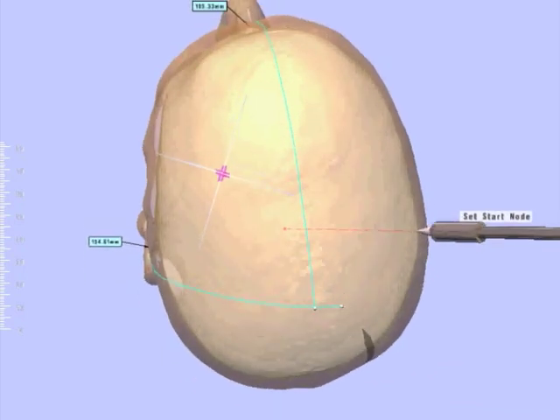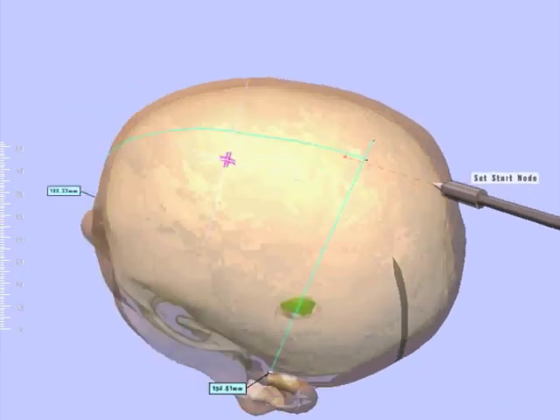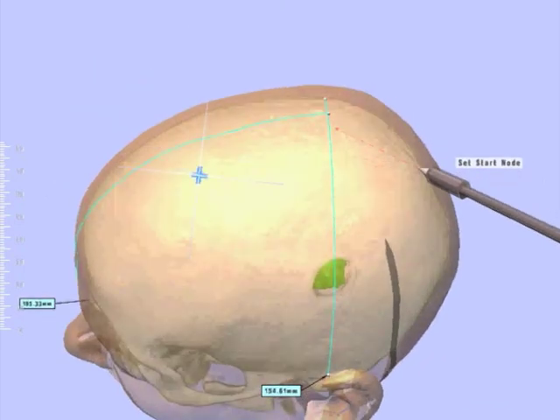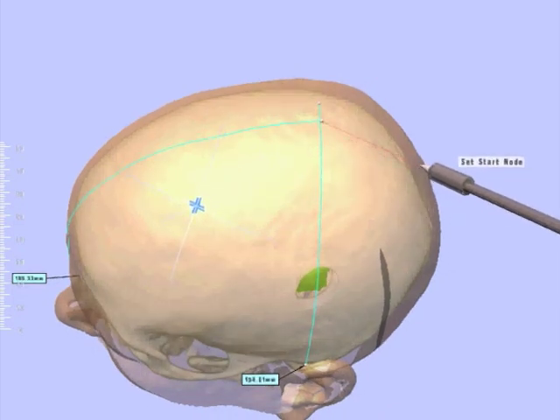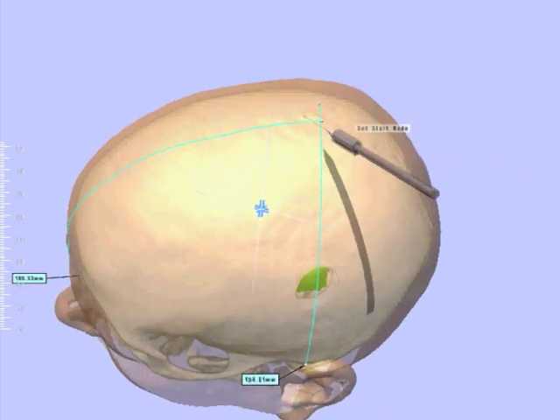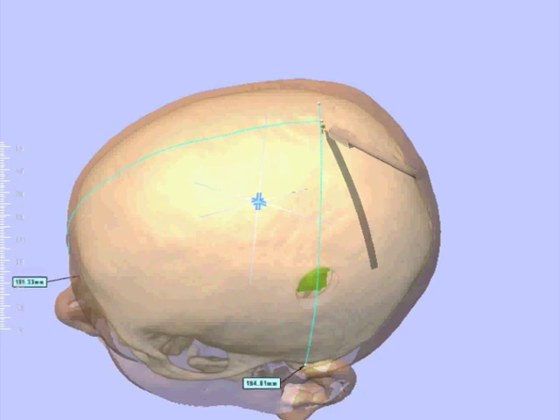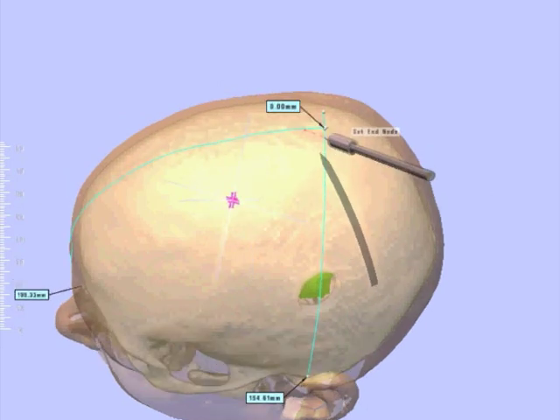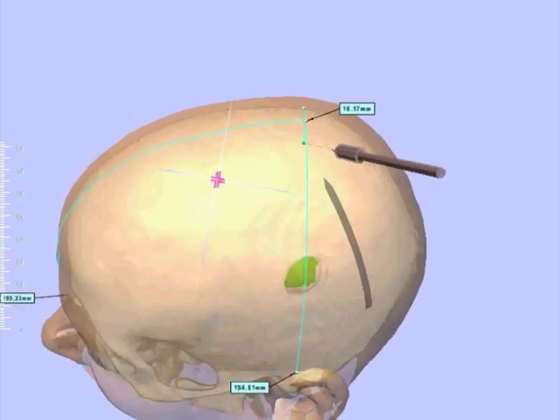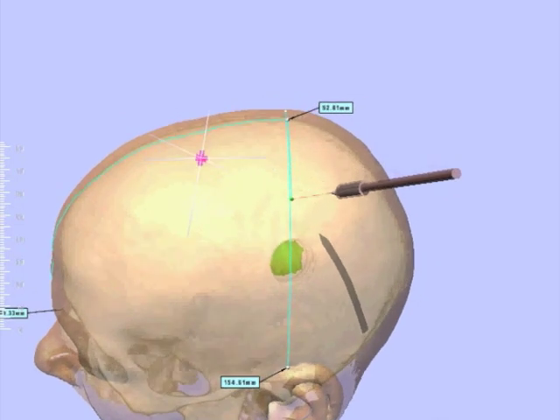From this point, we make a second measurement with the surface measurement tool along our auxiliary line until we reach the center of our planned craniotomy. This line has a length of about 8.2 cm.